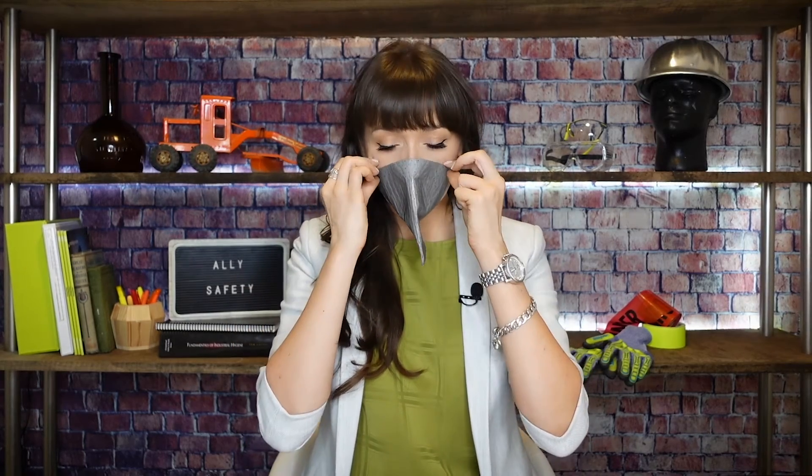How you put it on — I'm going to take off this top piece here as well. You put it around like you would a normal face mask, bend it around your face, and then you'll see this sort of corner piece coming out at the end. You just stick it together. This is the lightest one on the face of any that we're trying out today, and you can probably tell it doesn't inhibit you hearing me hardly at all. Now I'm going to take it off so you can see the difference. It comes off really easy. There is some makeup on the inside of it, but the glue is still sticky and you can wear it again. So basically, you can put it in your pocket and put it on later in the day. It's about as simple as face masks get.